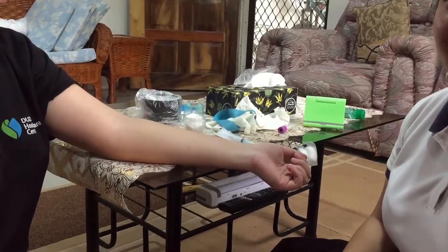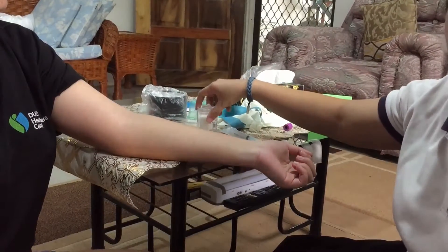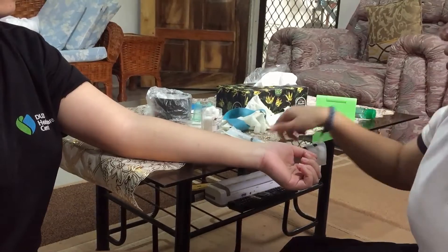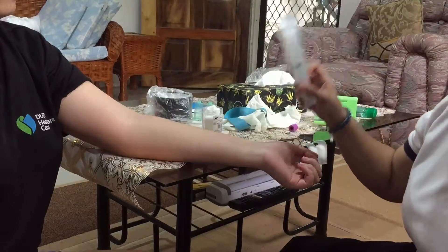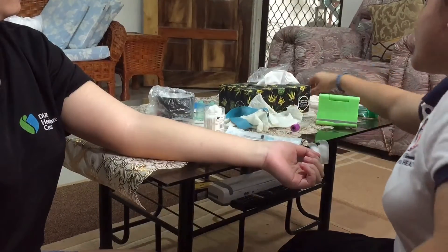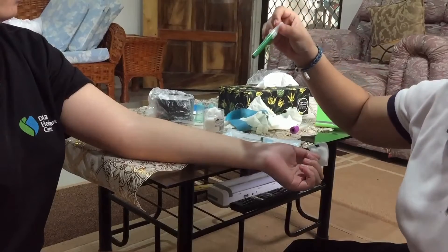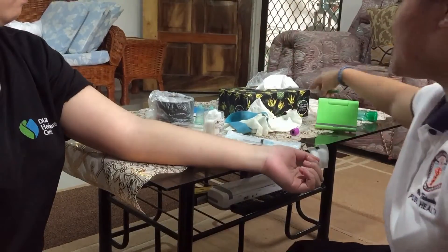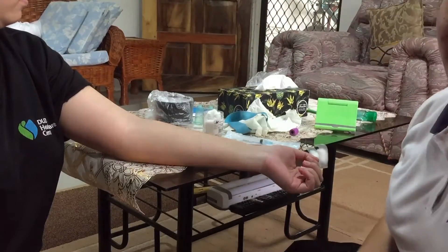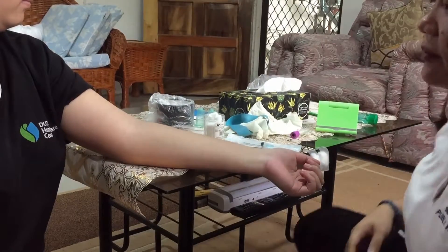Hello guys. For today's lesson, we'll be tackling venipuncture using the syringe method and your ETS — your evacuated tube system. We'll also tackle skin puncture.